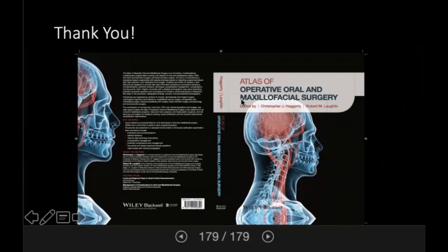Dr. Hassan, just to throw in one more point, that's why it's nice to take out the teeth and put the patient in that immediate denture, because that immediate denture will help to establish the vertical dimension of occlusion and the vertical restorative space. And even though 9 millimeters is the minimum space that we need, most patients typically do end up with 12 to 15 millimeters of interarch space. So usually that is not going to be a problem unless you have a patient that's significantly overclosed.